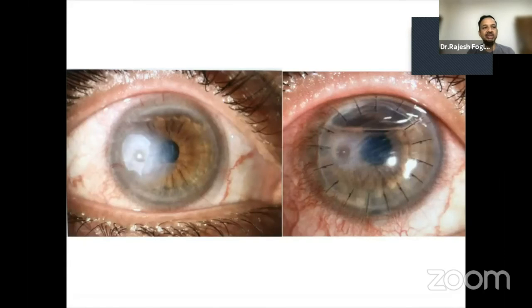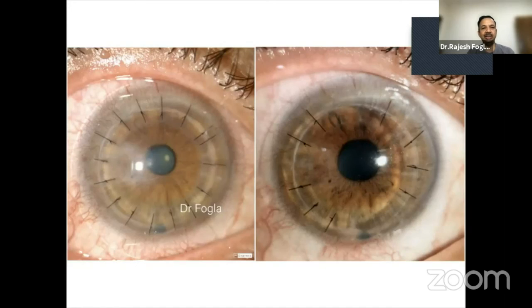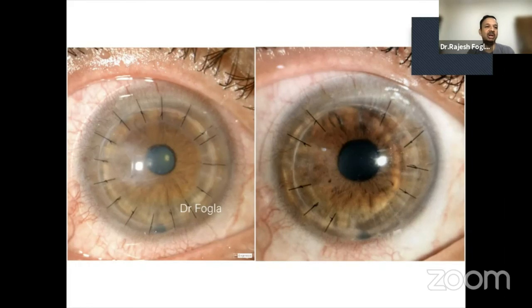Once the infection is resolved, you can sometimes have corneal thinning or perforation, which was managed with glue and amniotic membrane. The patient was recommended for a full thickness graft, but we did DALK and this is how the patient did. Despite having a two millimeter perforation, a DALK can be performed with good outcome.